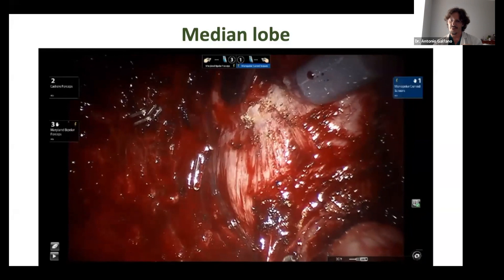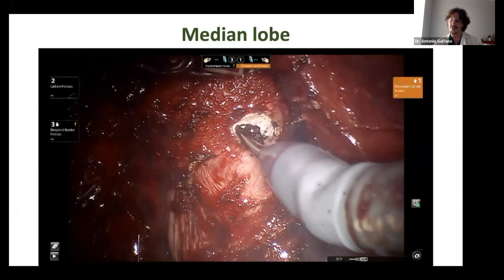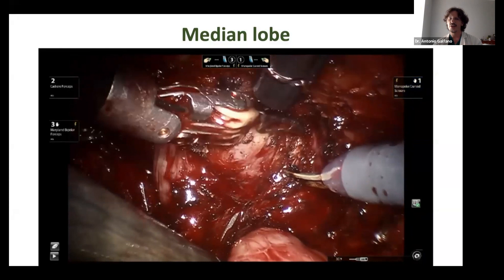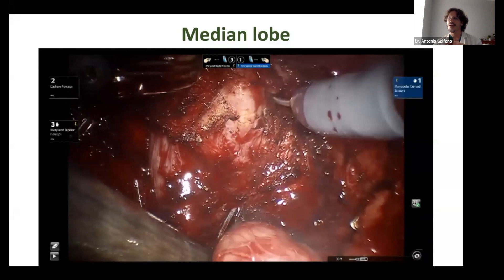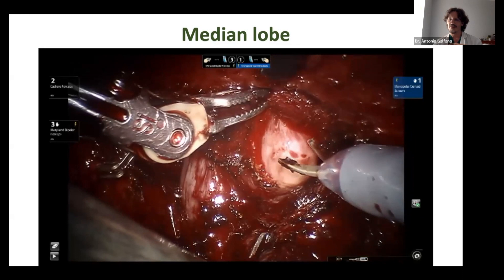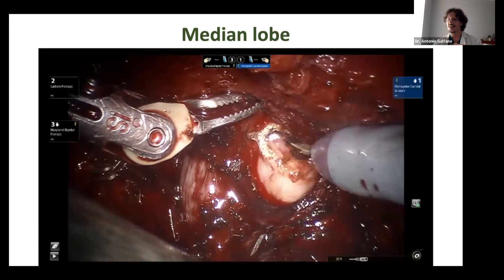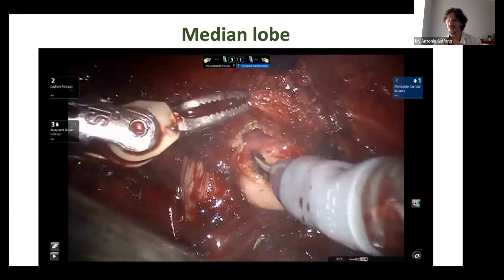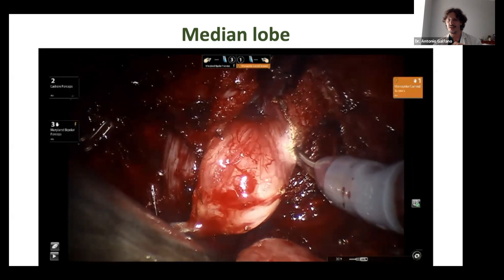From lateral to medial, you shape the median lobe, incising the fibers and applying traction downwards to extract the median lobe from inside the bladder. The mucosa shows us the end of the median lobe, and now the median lobe will come out. We continue surrounding the bladder neck exactly as before.